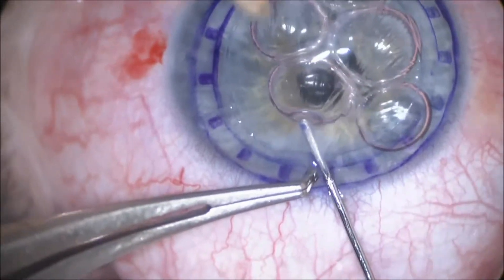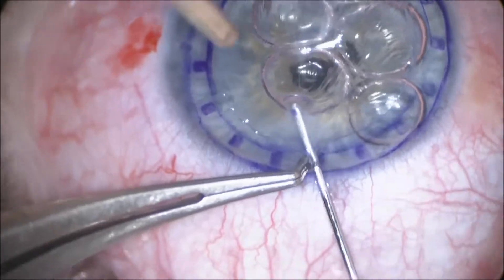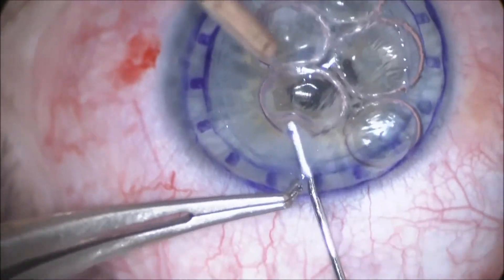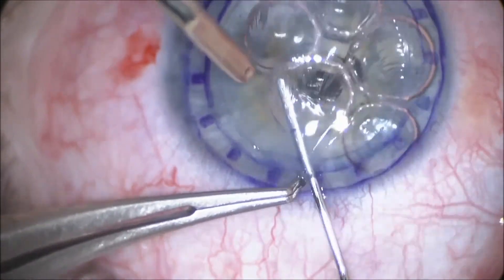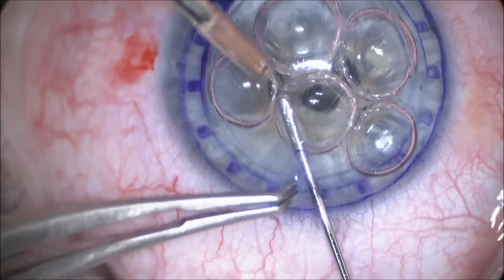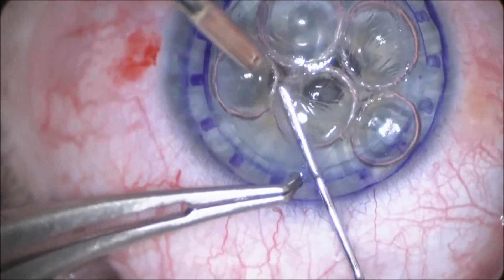Now once you've created a channel, here we're using the Fogla catheter and advancing it along the pre-made channel with the pin.